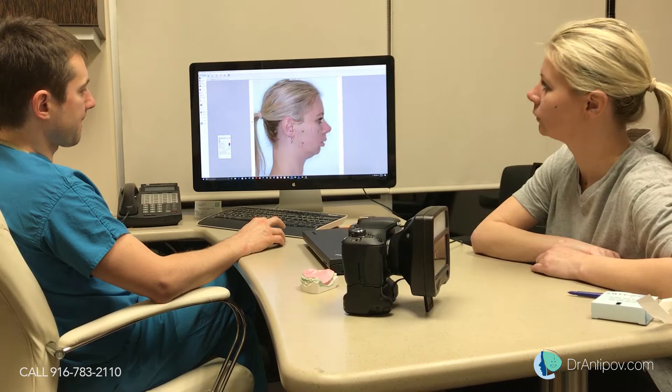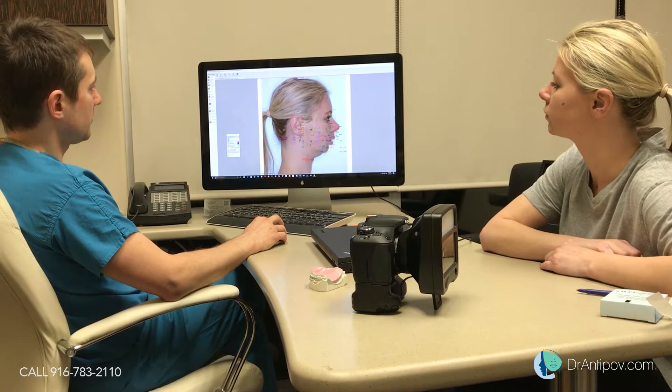Now based on this evaluation, we're going to do the planning of the face in the 2D profile only.